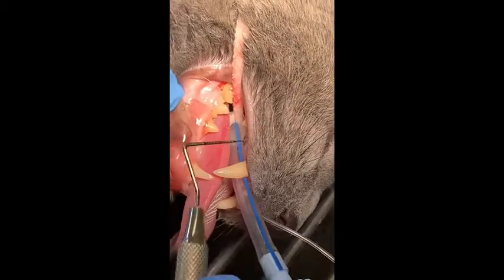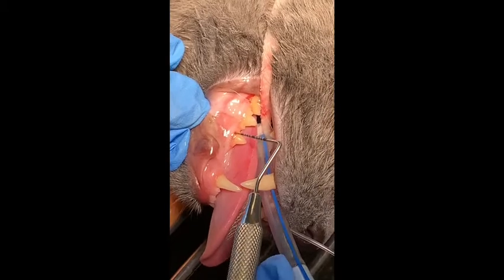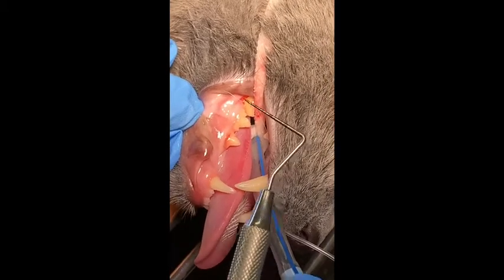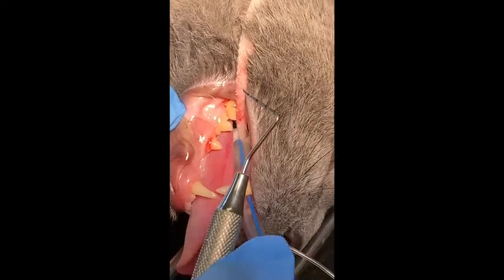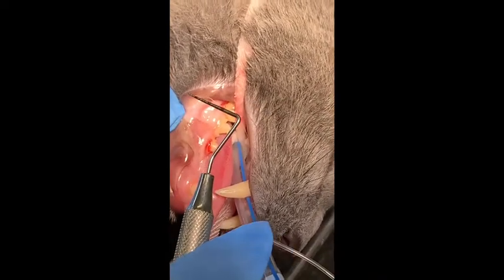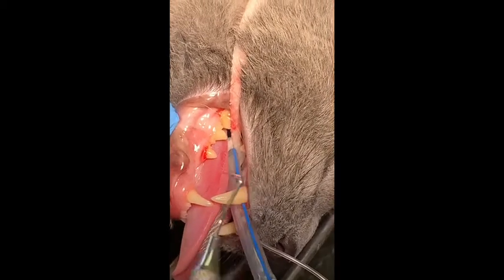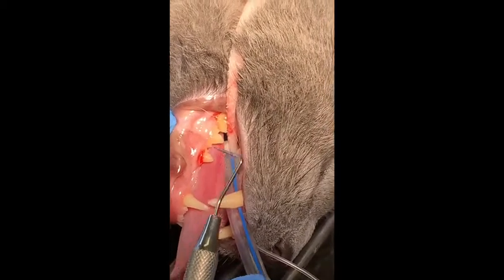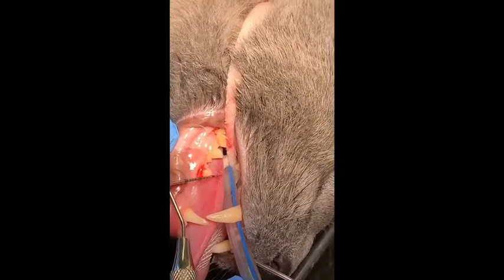And you can see there's a small amount of gingivitis because it is bleeding a little bit. So I would probably say that's a grade 2 because it's showing a little bit of bleeding when you're probing it. And you can see there's no recession like there is on the canine. The tooth looks quite healthy, and again, there's no mobility in that tooth.